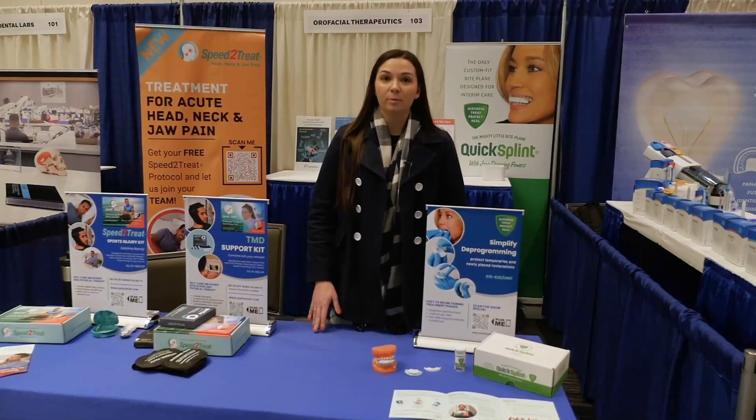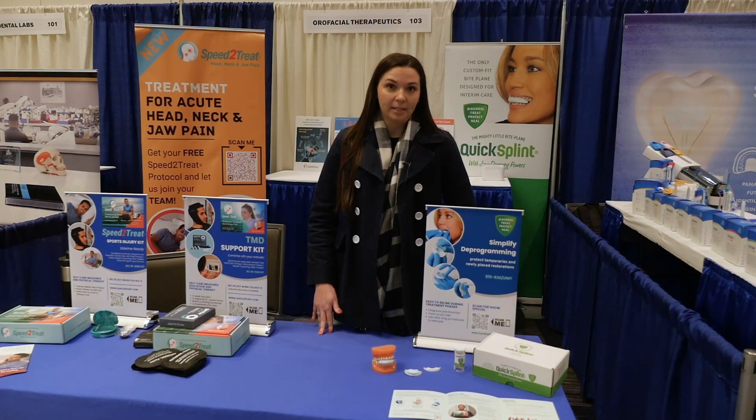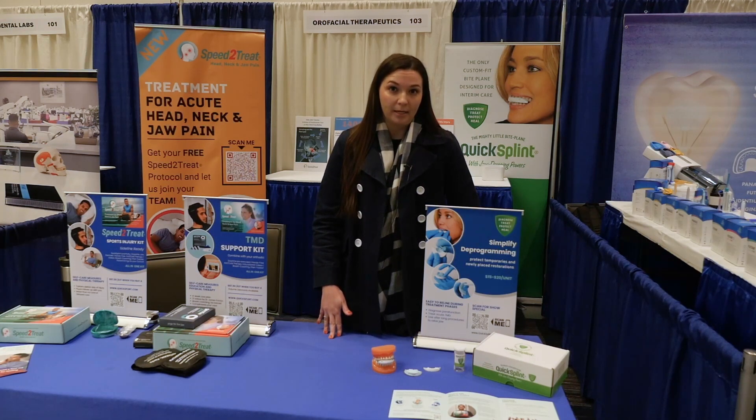QuickSplint is designed for short-term use and is popular with AES dentists for deprogramming before taking bite registration, and can be used for acute jaw pain. It can also be used to protect temporaries.